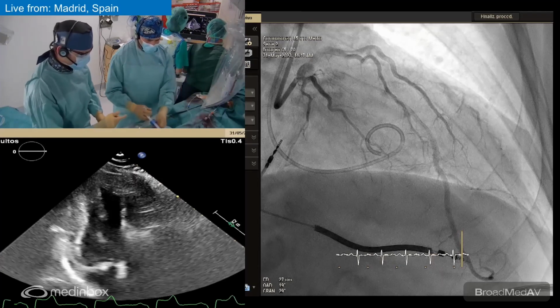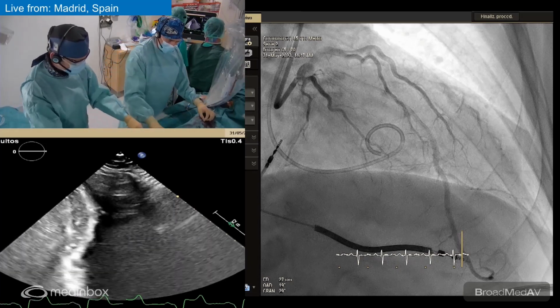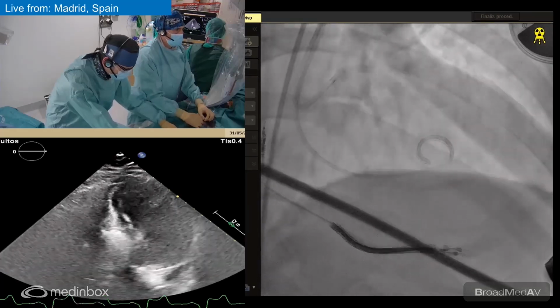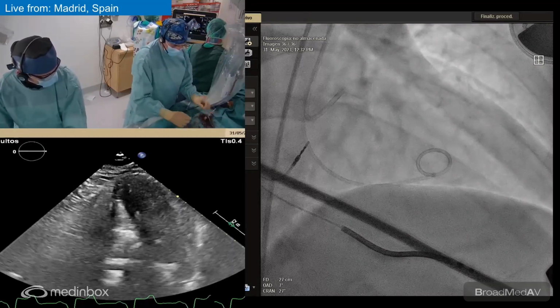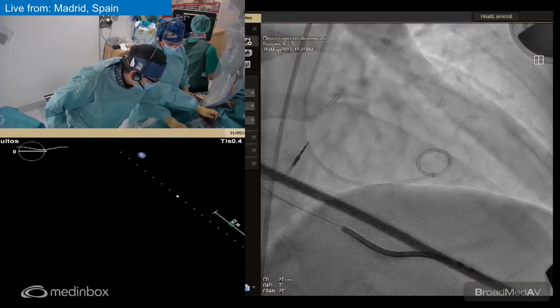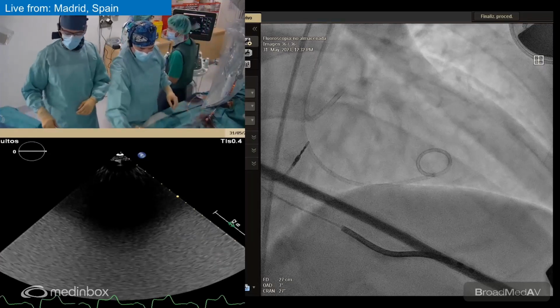Well, we have to wait 10 minutes after the last injection of alcohol. So we deflate the balloon, and we are aspirating with negative pressures to retrieve the balloon, because we will use this balloon another time, and not to lose the alcohol remaining in the LAD. Back bleeding here, and you are sure everything is out. Okay. So let's go with the wire again.